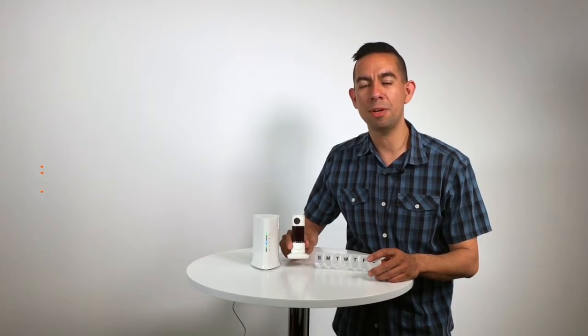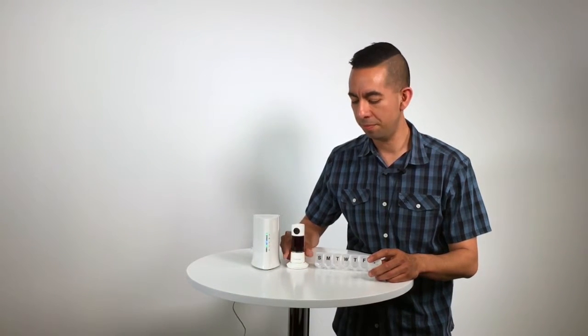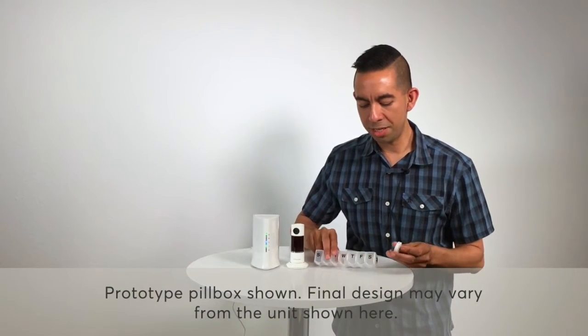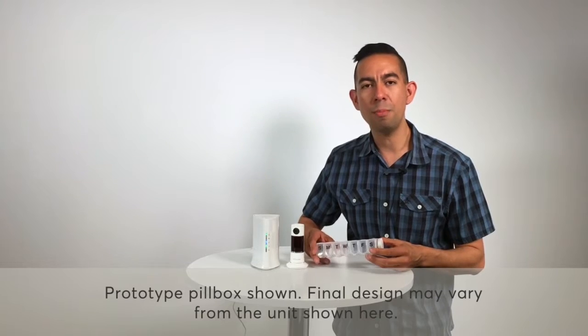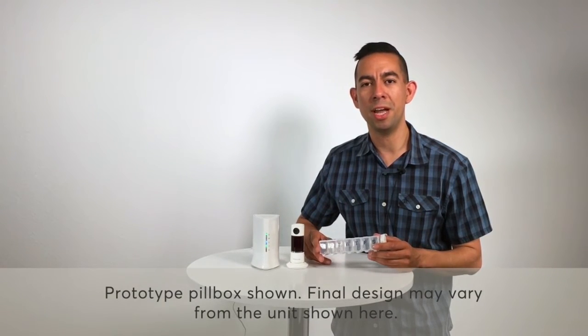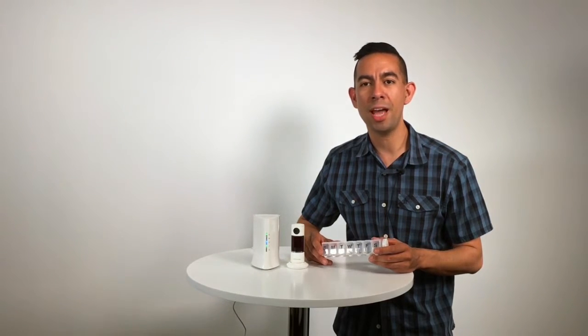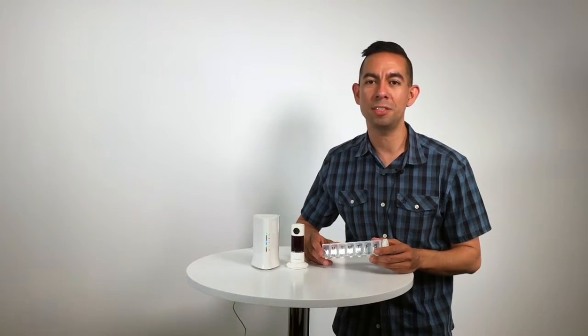It comes with a Twist HD camera so you can take a look at the area, a pill box, and a medication tracking sensor. You connect it to the pill box, and it automatically logs the motion of someone picking it up so that you know that they took their medicine. The report comes to your HomeAte app, so you can make sure that their medicine is on schedule.